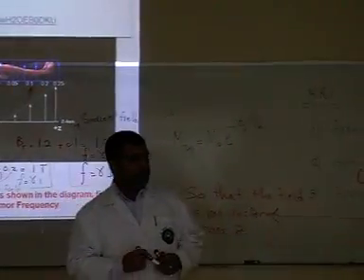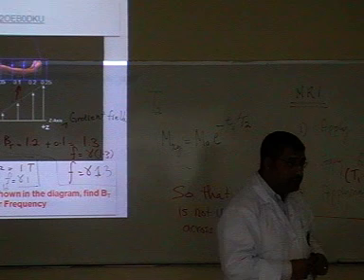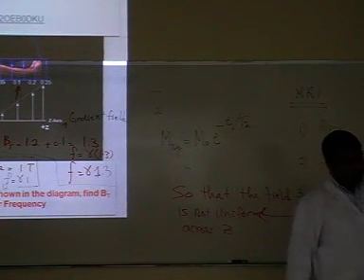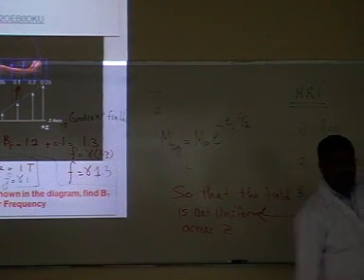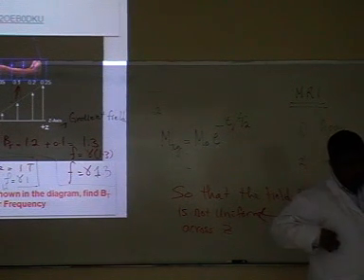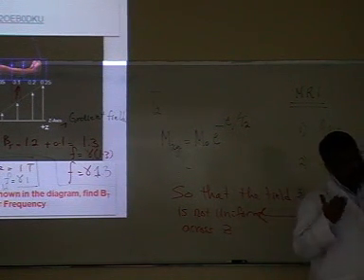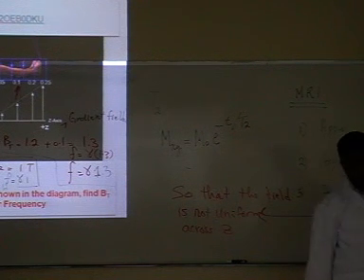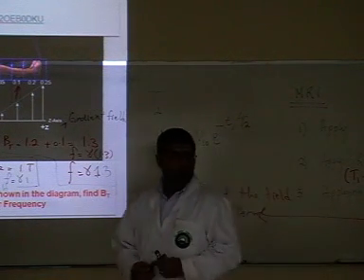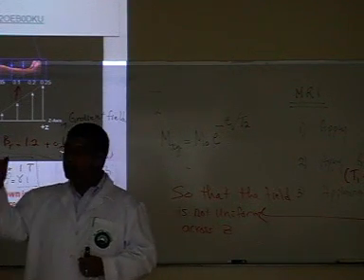Is the gradient field fixed? It varies with Z. It's not fixed. It varies with Z. At some point, yes. If you pick some point along the Z axis, that value is fixed. But it varies along Z. You want it to vary along Z. If it does not vary, then it's not going to give you what you want. It's not going to produce your image.